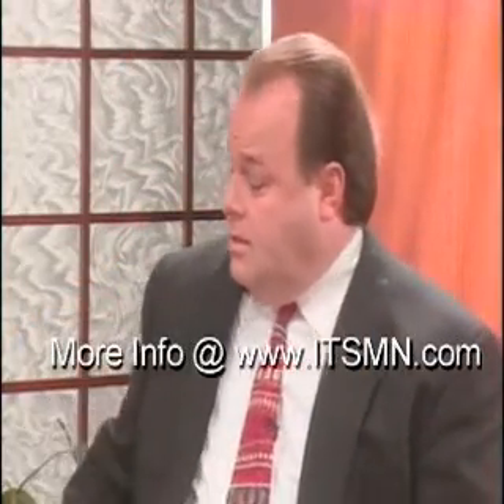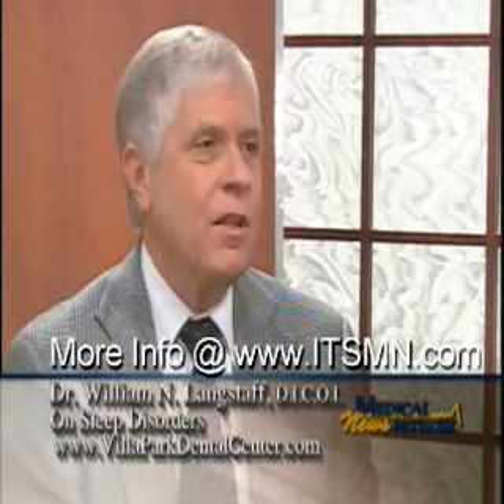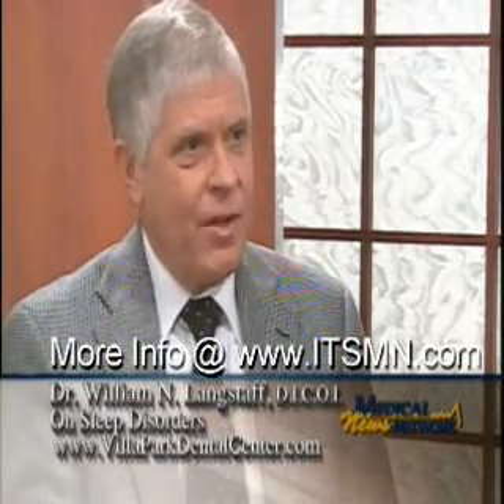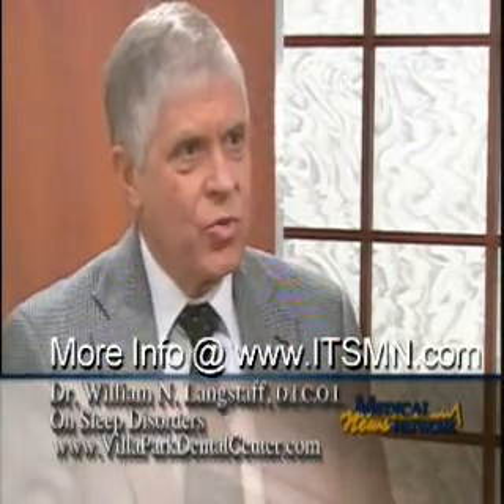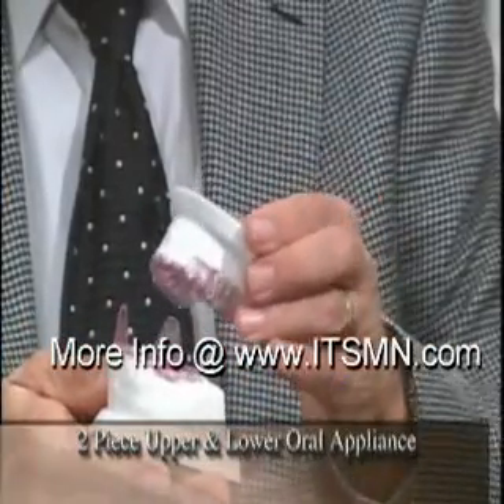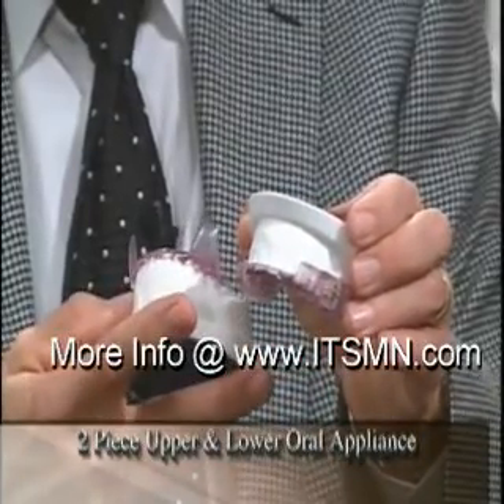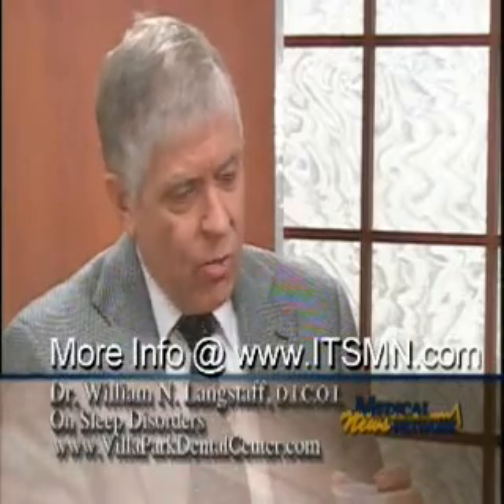So I come back and I'm not one of the severe cases — I'm not one that definitely has to have one of these. What do you use to treat it? As an alternative to a CPAP machine, oral appliances — as designated by the American Academy of Sleep Medicine. There are almost a hundred oral appliances that have been approved by the FDA for sleep apnea. I brought just a few examples, the most recent ones. This one is from Australia, the most recent one. Basically, what these appliances do is advance the lower jaw and open the bite.